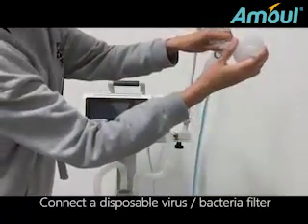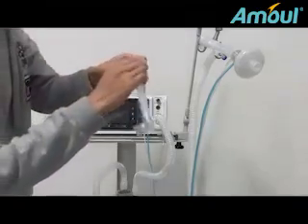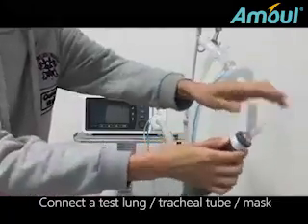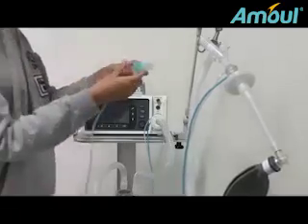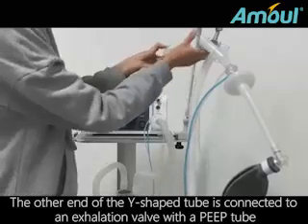Connect a disposable virus and bacteria filter. Connect the breathing tube. Connect a test lung, tracheal tube or mask. The other end of the Y-shaped tube is connected to an exhalation valve with a PEEP tube.